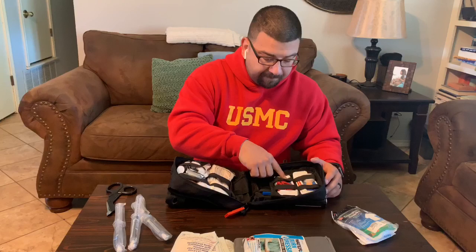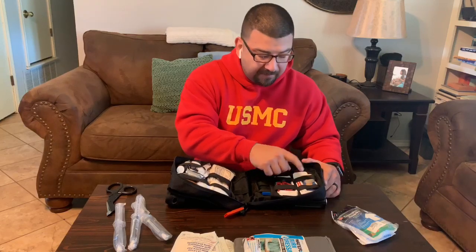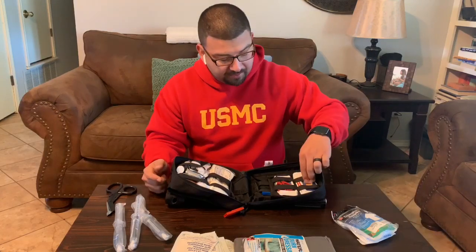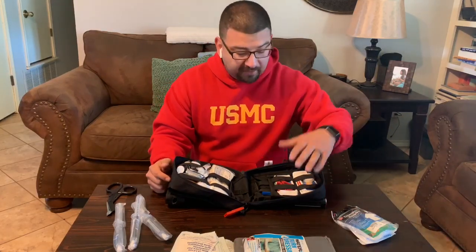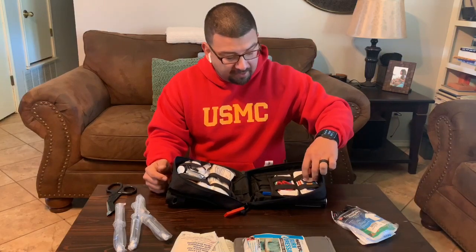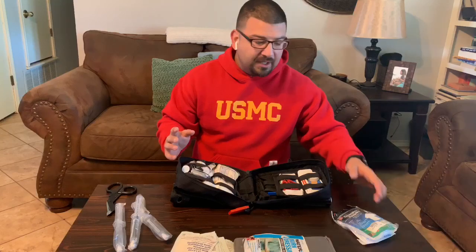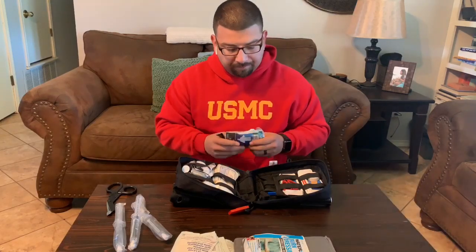On this side again, I have little butterfly bandages here, and then regular bandages there, which I always use those because you run across kids that fell off their bike or fell out of a tree, stuff like that. So that's what I use there. And then on this side, just a little bit of tape. So nothing too crazy in my bag.